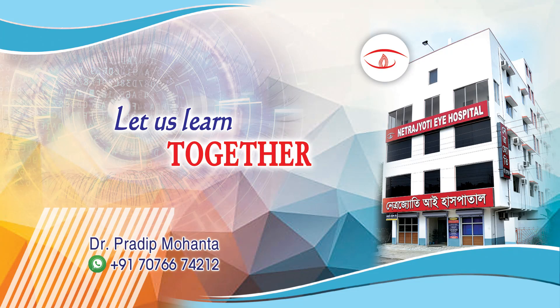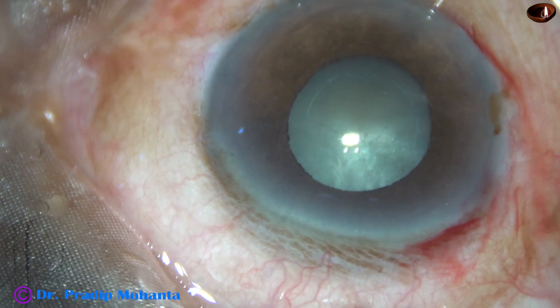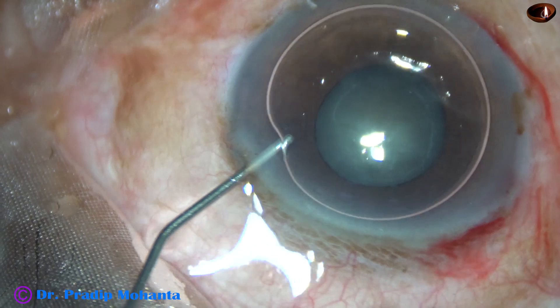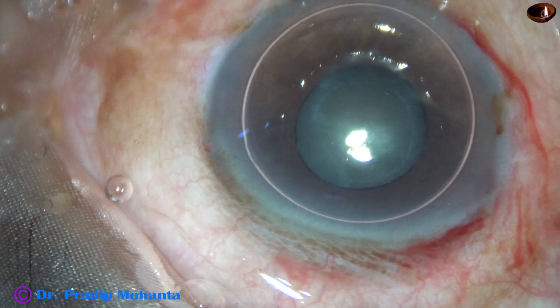Friends, welcome to my workplace at Ranagh Heart, West Bengal, India. This is a mature white cataract with pseudo-exfoliation and small pupil. Let us observe this surgery.